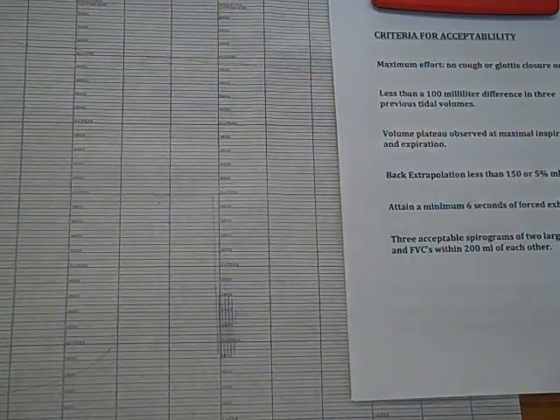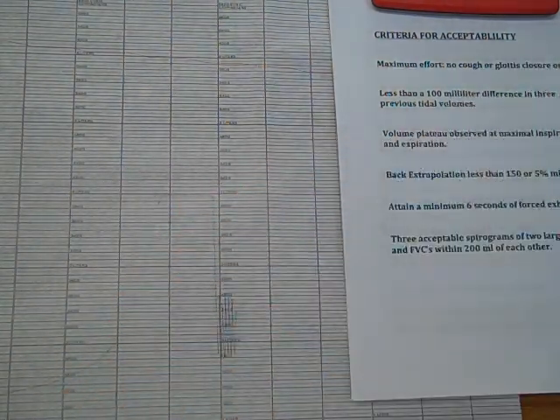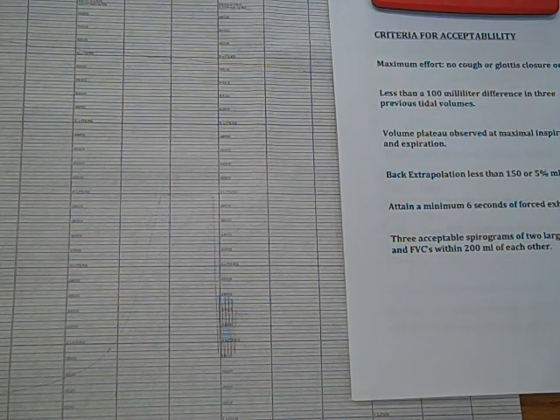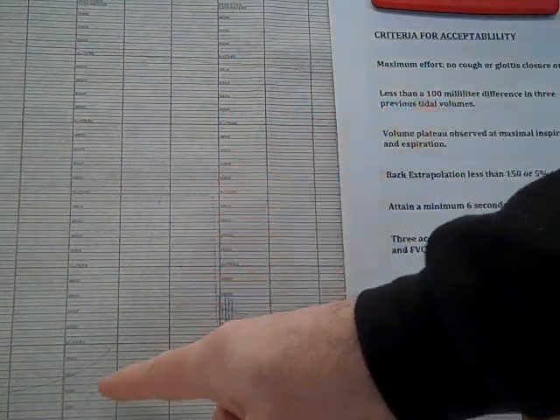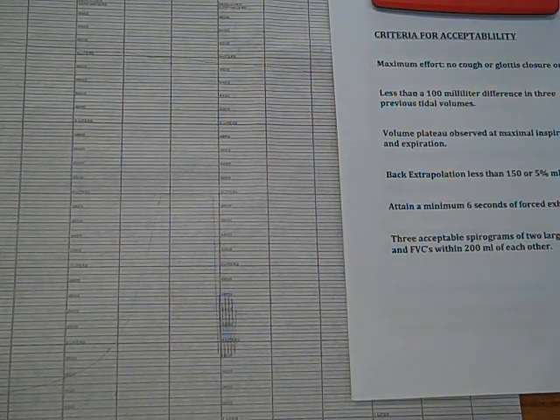Now, the criteria for a test to be valid: we need a maximum effort with no cough or glottic closure. These are often seen by little ripples on the tracings. Less than 100 milliliter difference in the tidal volumes. A plateau is observed on inspiration, hold, and on the exhalation, which on this tracing was very apparent. A back extrapolation of less than 150 milliliters or 5%.